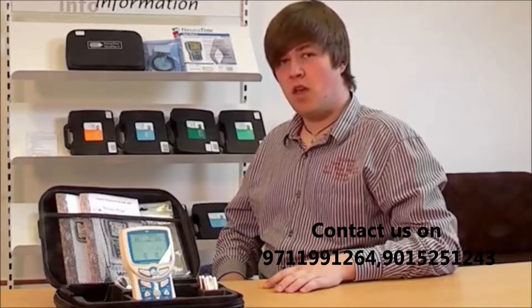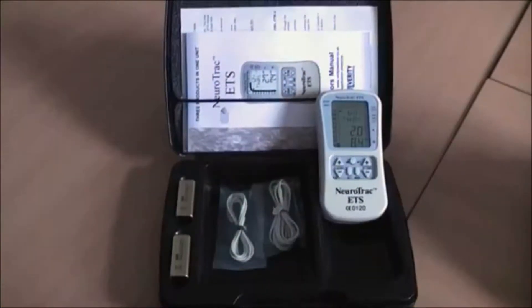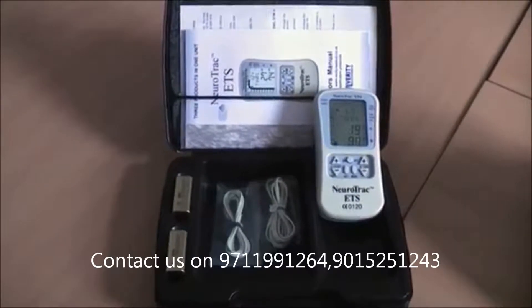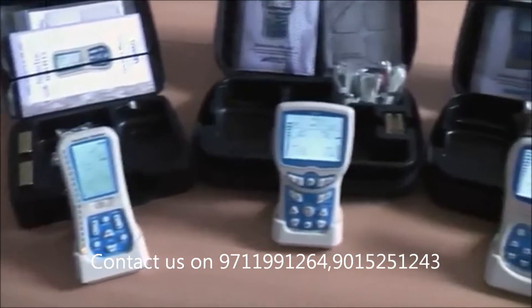Hi there, my name is Peter and I'm here with a new video from Verity Medical to show you some of the exciting features of the Neurotrack Maya Plus 2. The Neurotrack ETS is a device that many of you are familiar with, but now it has been superseded by the Maya Plus range of devices: the single channel Maya Plus 1, the dual channel Maya Plus 2, and the quad channel Maya Plus 4 and Maya Plus 4S.